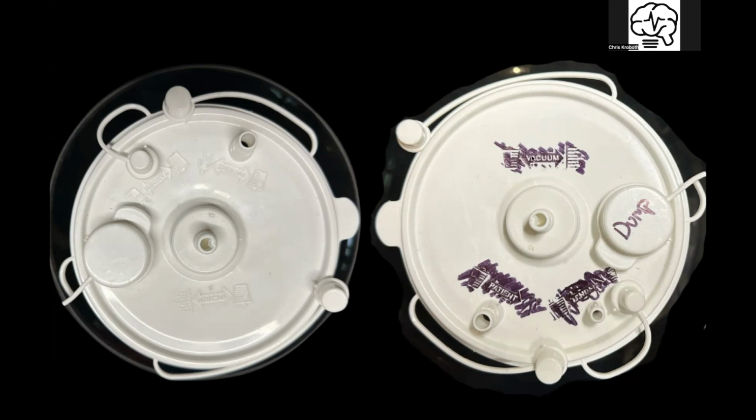So, vacuum. The center port right here is what goes to the suction or the vacuum. This is how it makes that negative pressure. This is where the patient's tubing goes. This goes to the patient. And this little port over here is if you wanted to hook up another one in tandem. So, you're going to be sucking so much junk out, you want to have two canisters running in tandem. Then, this big port right here, it's not labeled, but you'll see my fourth grade handwriting. I wrote dump on there.